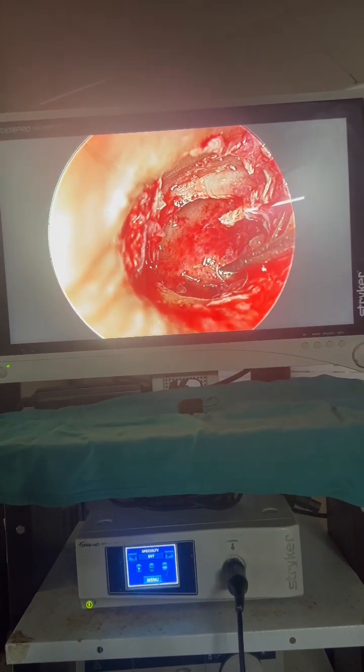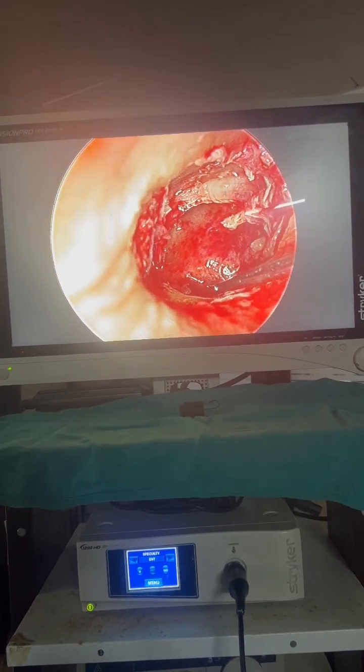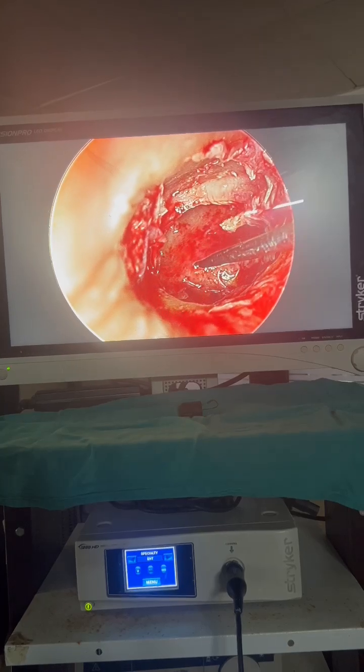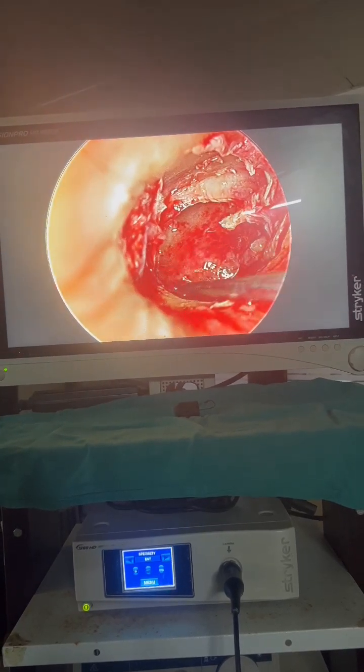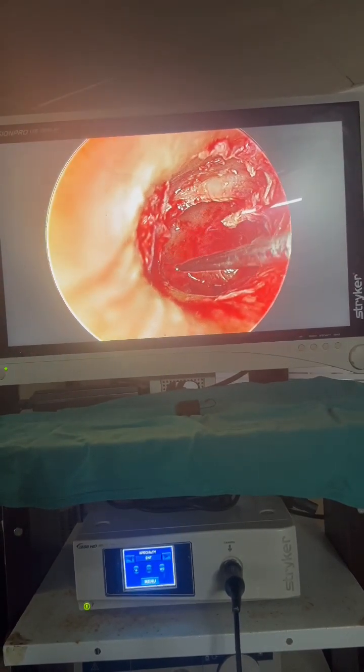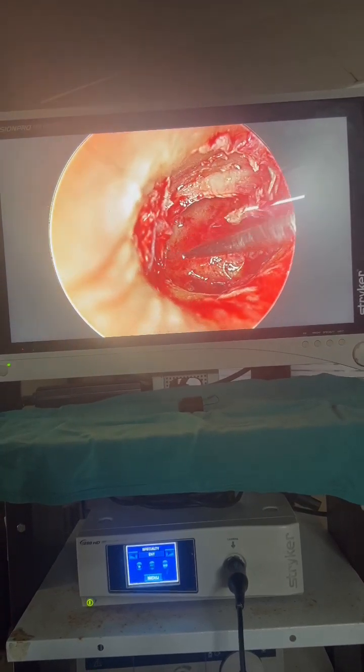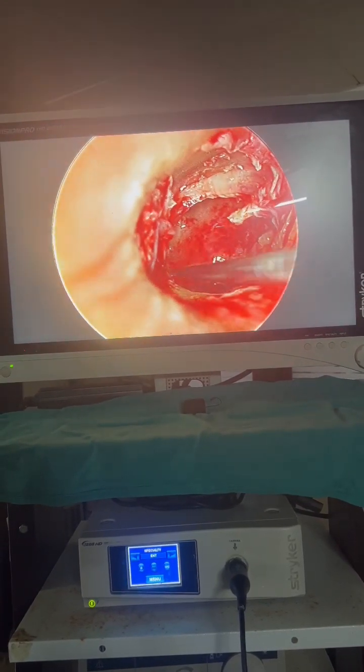Below the subiculum is the subtympanic sinus, that is below this. And now you can see the promontory and this bony ledge. This is the finiculus, because it separates the retrotympanum from the hypotympanum. The retrotympanum is separated from the hypotympanum by this bony ledge, which is the finiculus.